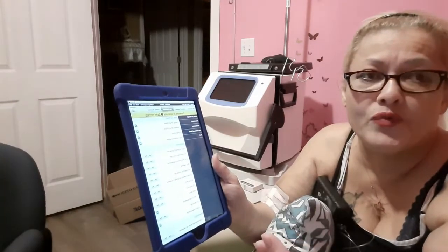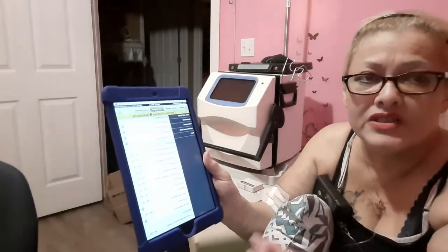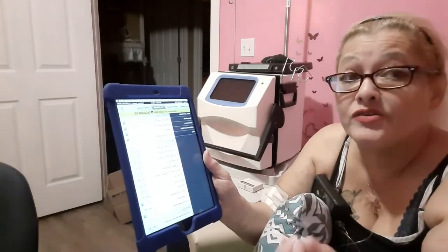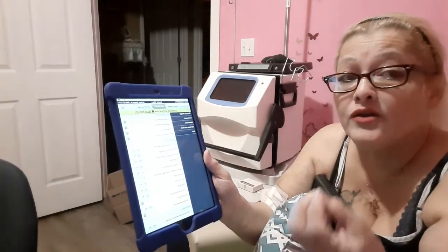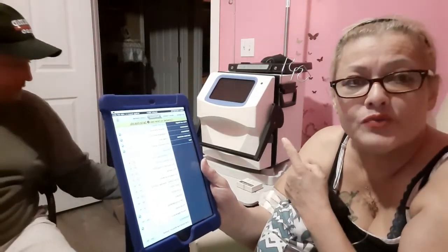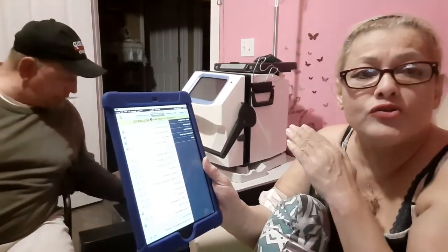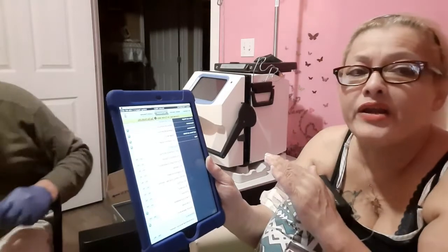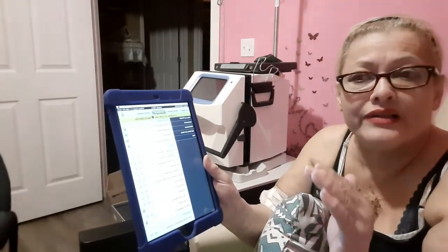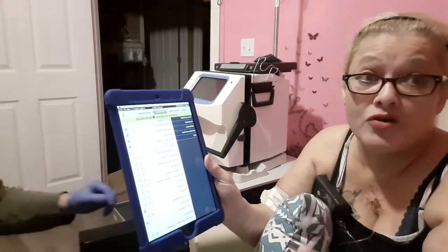It's going out a different way. But anyway, I'm just trying to help you understand how it could be very stressful on the heart to dialyze. So this is like the slowest process when you do it 6 days a week. And nocturnal, when I go into nocturnal while I sleep, it'll do it at a slower pace to where it's the least stressful on your body, especially your heart.